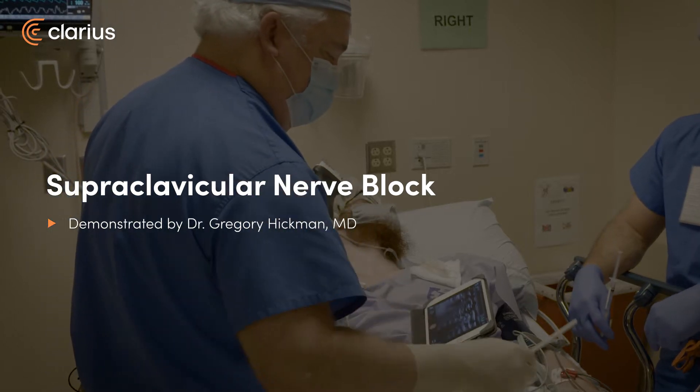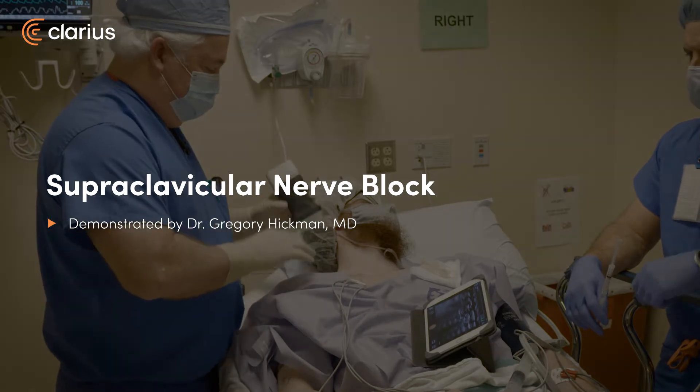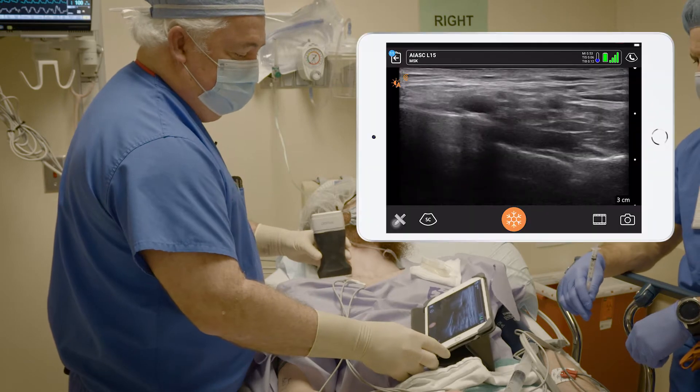We've got a young man having an ulnar nerve transposition today. We're going to look at his supraclavicular approach and do a corner pocket if we get a good view.